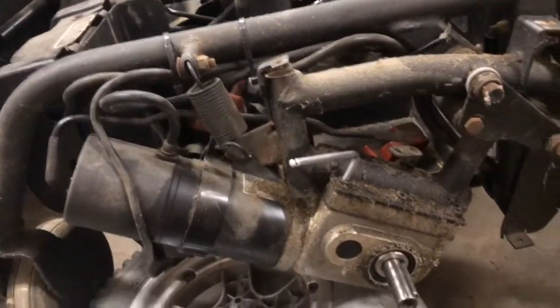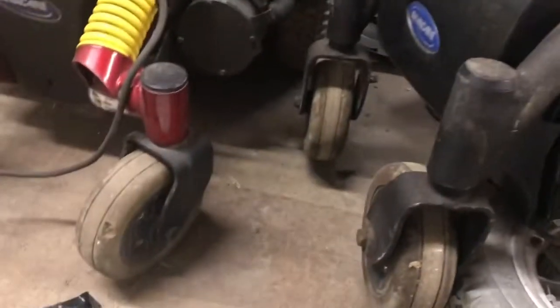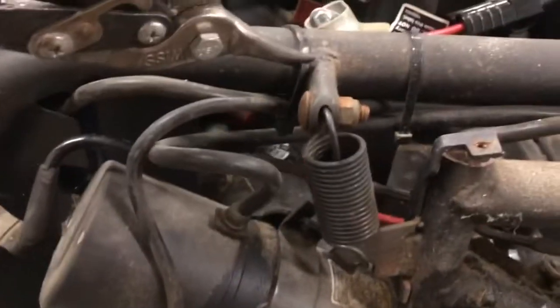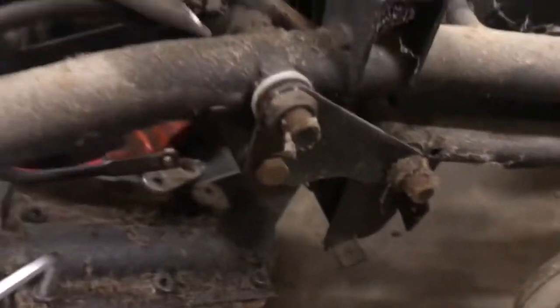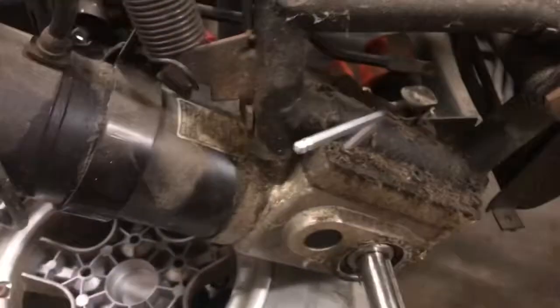So you do have a lot of cord here, so you can take it off, but let's go ahead and cut these zip ties. You want to make sure you don't cut the actual cord, so be careful, not to rush this part. What I like to do is stay away from the cord as much as possible. Just don't even play that game. There you go. Oh goodness. Okay, there's another one. You definitely want to buy some zip ties.